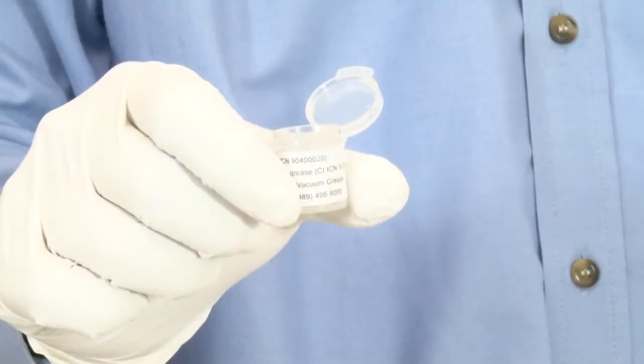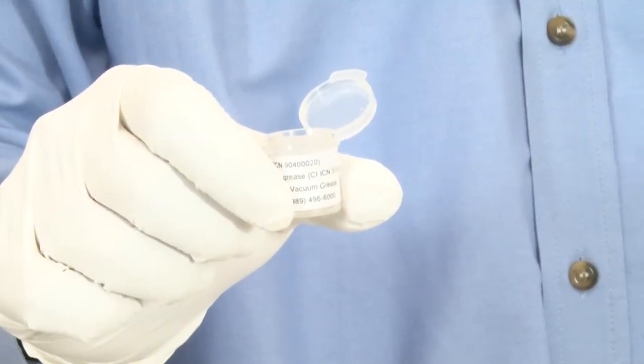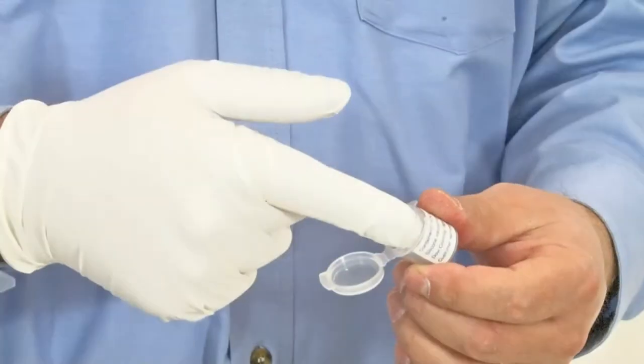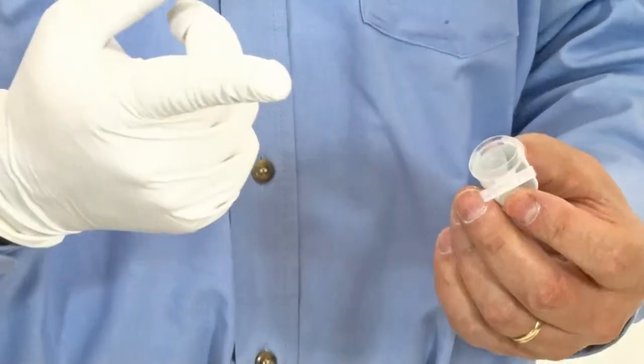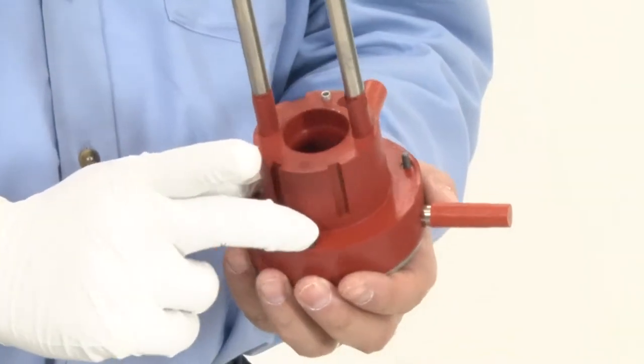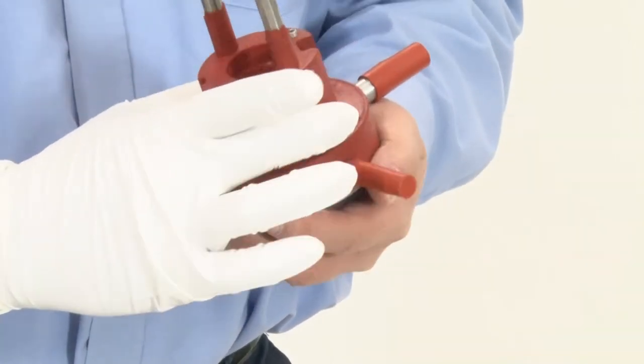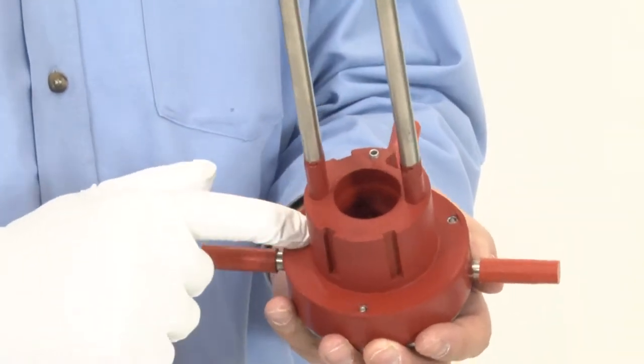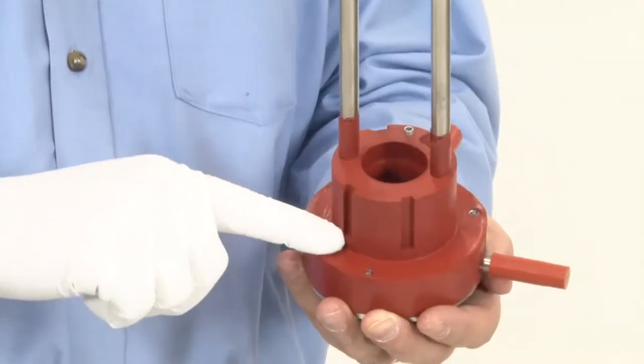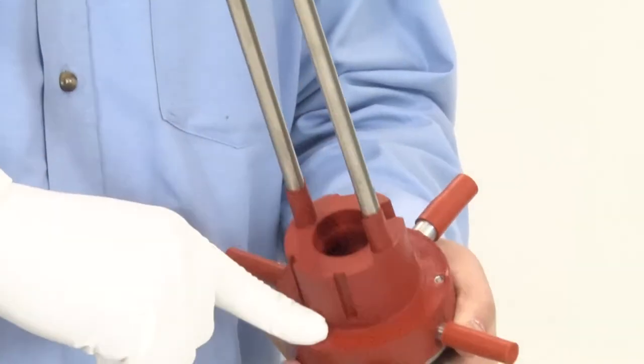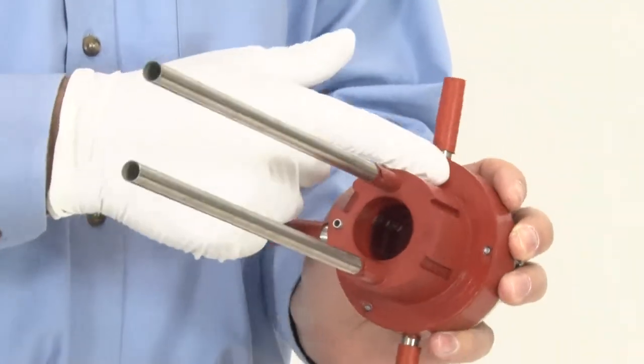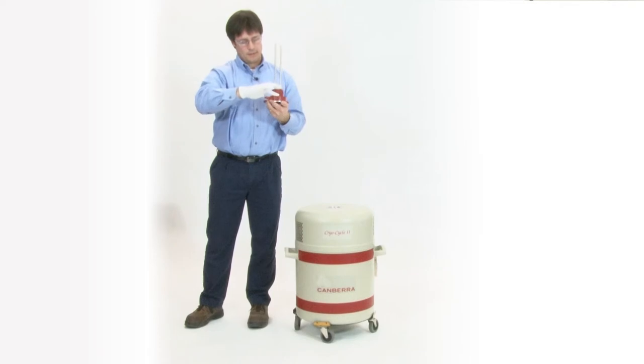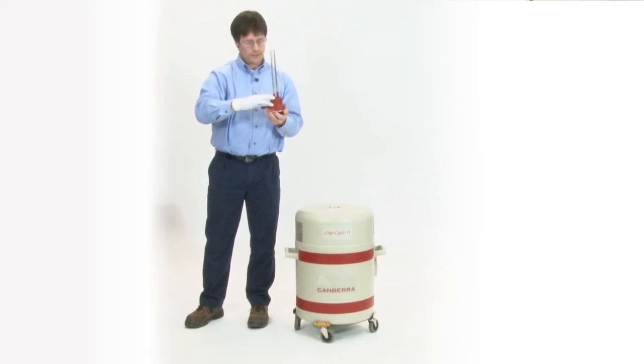After that, we take our supplied vacuum grease. So just take a little bit on your finger, about pea-sized amount. And you can see the clamp ring and the screws are already installed, so you need to push the screws down so you'll have the flat surface to install your grease on. So that pea-sized amount, you just spread it around on this edge of the collar and try and get a nice, even film throughout the collar.